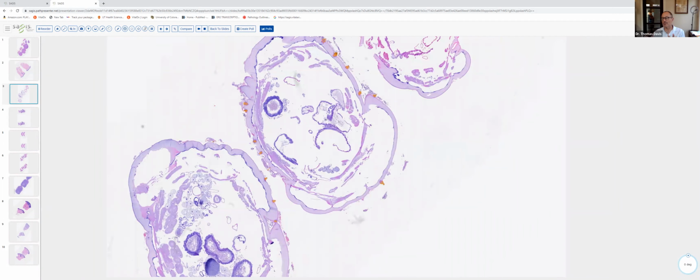And if you see the two organisms in tissue section, the gravid sandflea causing tungiasis tends to embed in the outer layer of the epidermis, whereas the botfly larva is typically found deeper in the dermis and induces a really robust inflammatory response.